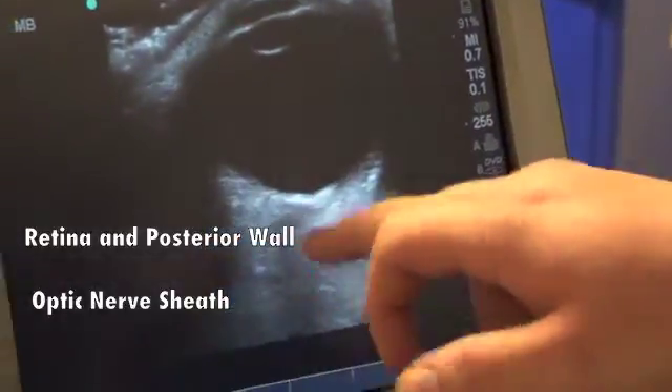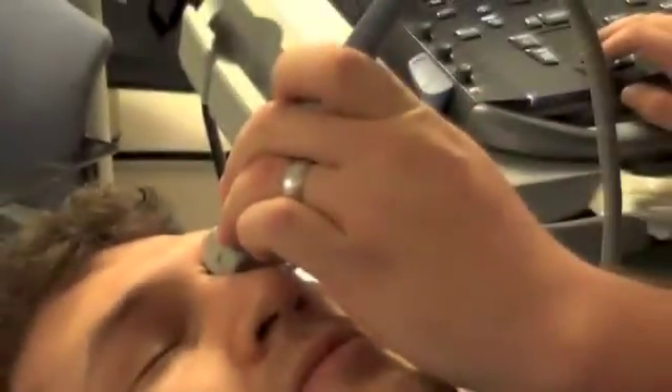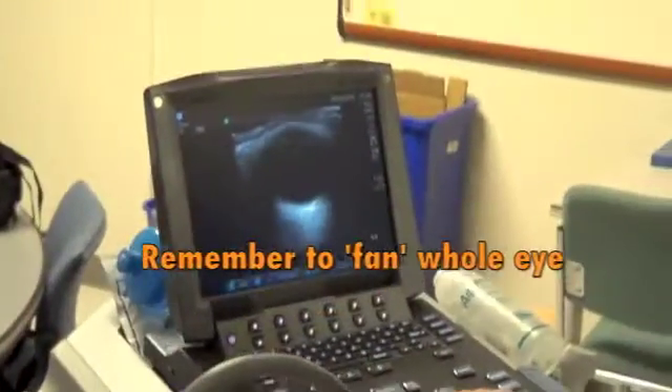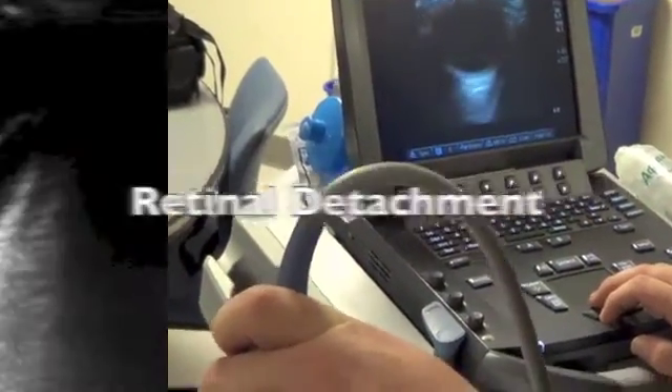You're also going to have your retina, which is going to be this gray line. And you're going to start to see your optic nerve as this grayish hypoechoic structure. You're just going to scan, fan up and down, looking at the patient's full eye.